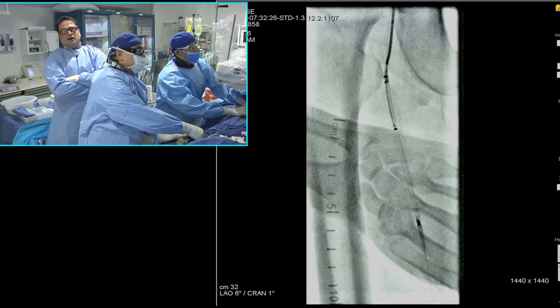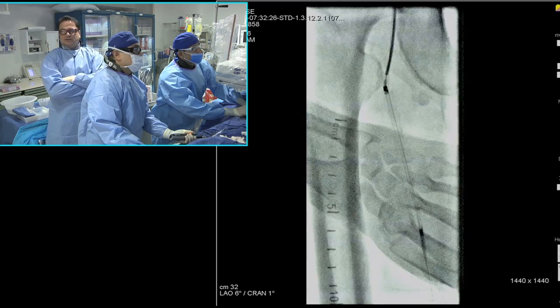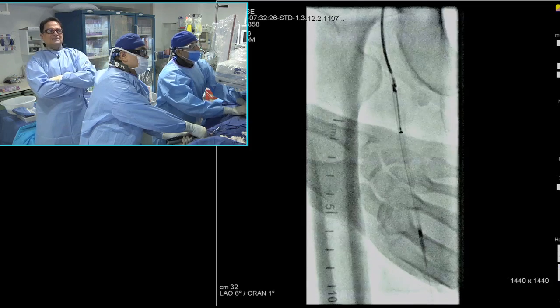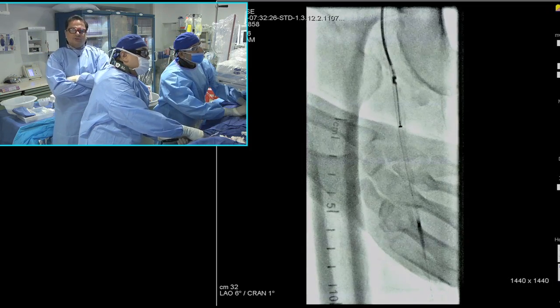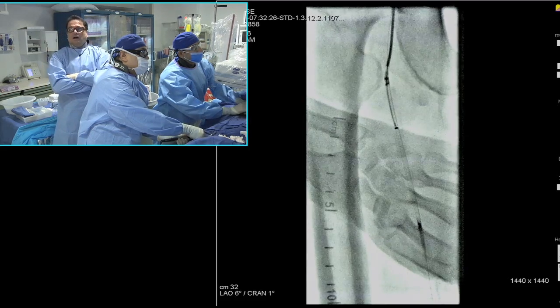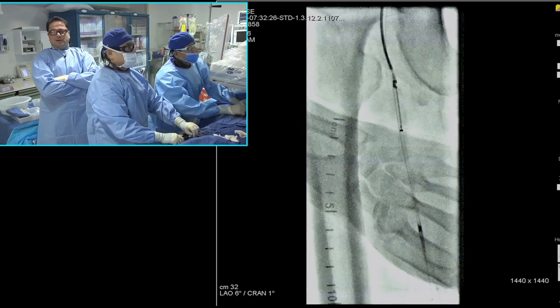Number three, when you're doing in-stent restenosis, regardless of the device you decide to use, you should use a filter. Because I think that in-stent restenosis has a lot of thrombus involved that people don't realize. And also, if you're using certain devices, you can macroscopically embolize this debris. Number four is anywhere where you suspect thrombus.